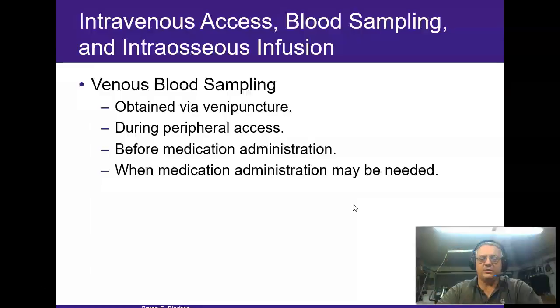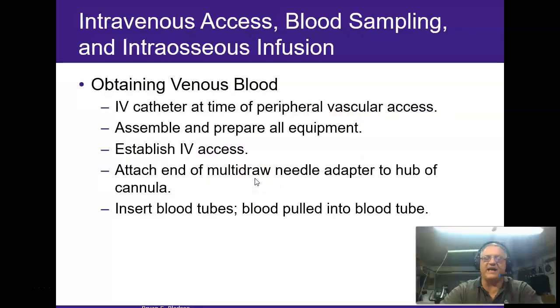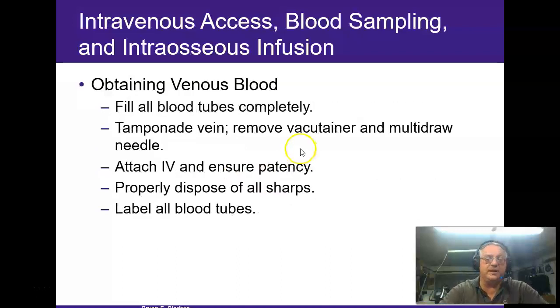All right, getting a blood sample. Again, you want to make sure that you do this before you start flowing fluids. The blood tubes are usually made of glass. They have a vacuum inside of them, and they have a self-sealing rubber top. Again, you can draw it with a syringe, by the way. You can draw it with hypodermic needles and use vacutainers in which to do this. We've already done this in lab, so I'm really not going to harp on this too terribly much.